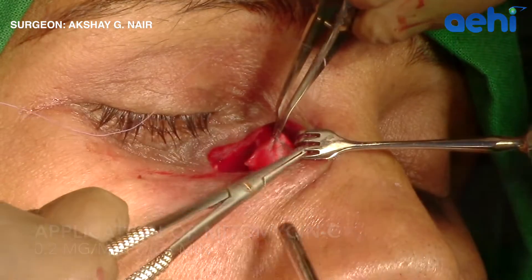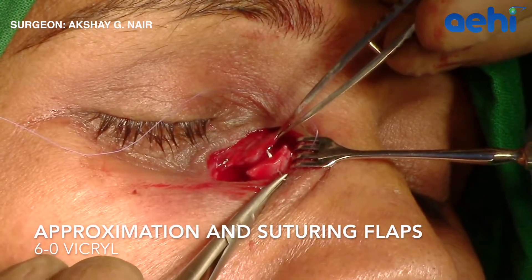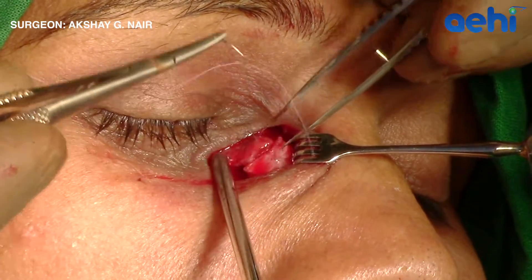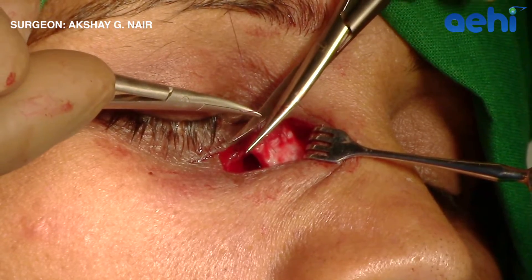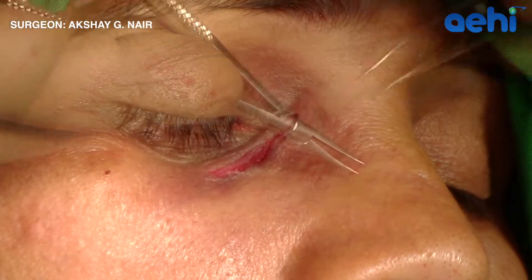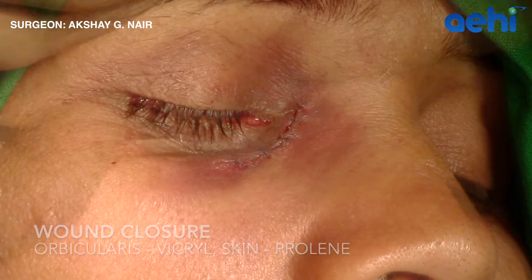Adjuvants like mitomycin C can be used at this stage. Following this, the nasal mucosal flap is approximated and sutured to the lacrimal sac flap. I prefer three interrupted sutures using an absorbable suture material like Vicryl. Following this, the skin and the orbicularis are closed in layers.